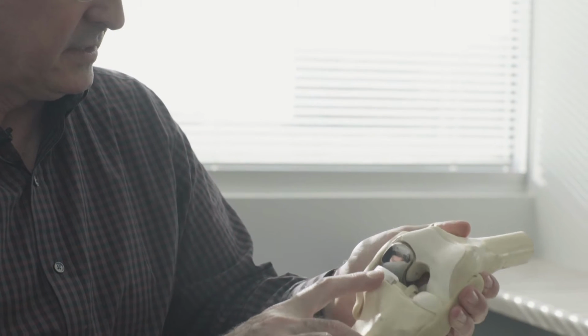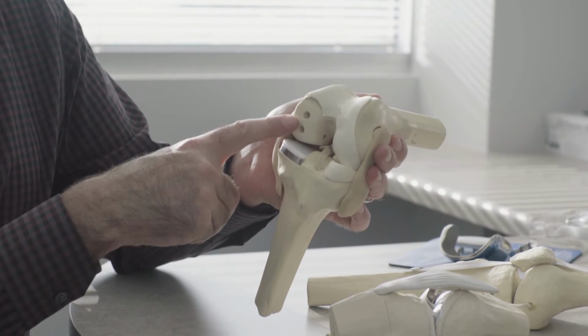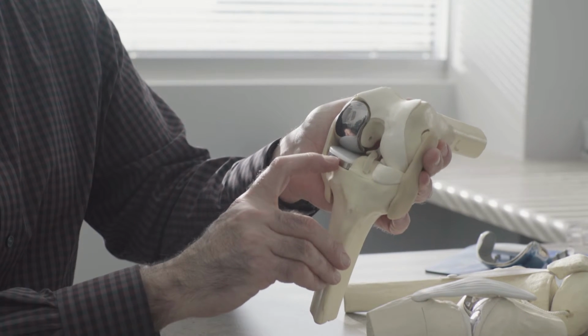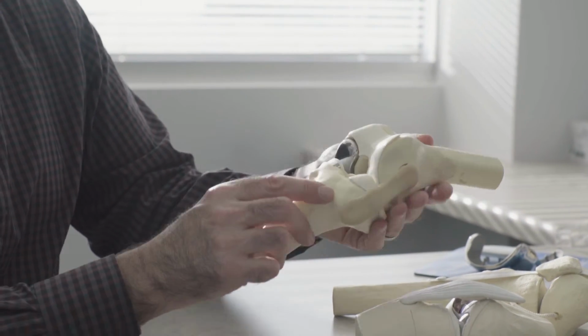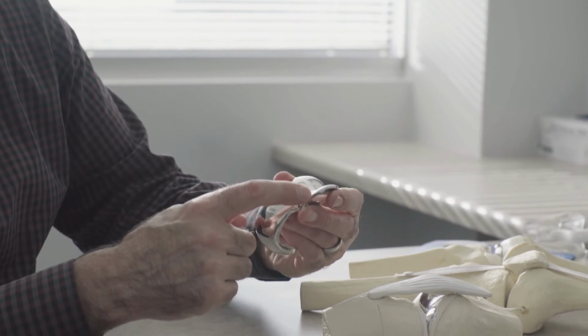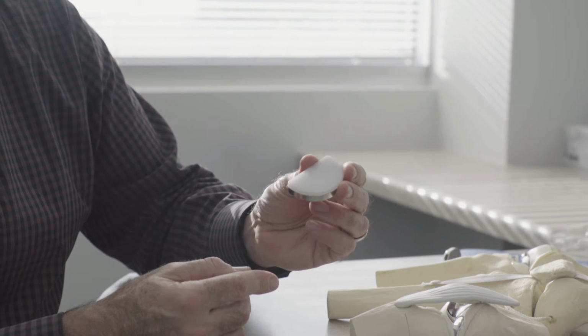The next type of implant is what I call an onlay arthroplasty or an onlay resurfacing device. In this instance, an onlay allows us to build up the joint. These implants are custom made, and the beauty of this is that no bone needs to be removed at the end of the femur, and the implant, which is custom made and manufactured through 3D printing, fits precisely on the bone. In this instance here, we can see it works on the tibia and the femur, and that's an example of an onlay. These come in different shapes and sizes as well, depending on what's needed, and this is an example of an onlay that goes for the front or the patellofemoral and the medial side of the knee. And these components cover the tibia as well.